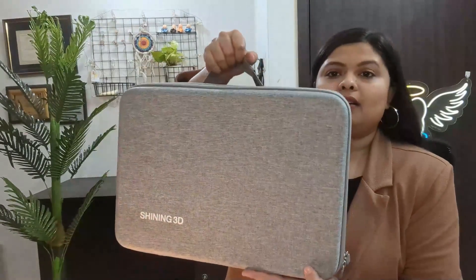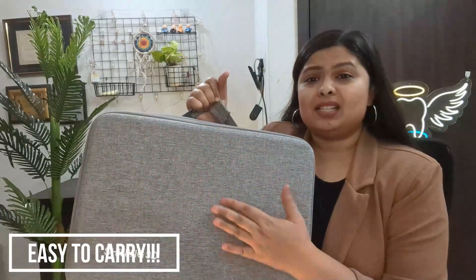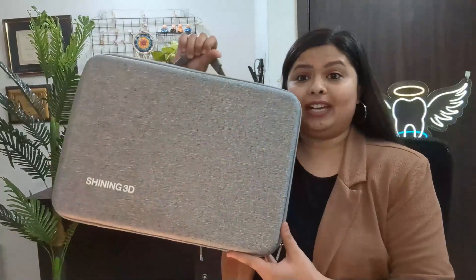This is the packaging — I really love it because it comes with a handle, so it is easy to carry and very sturdy. If I want to carry it for consultations or to another clinic, I can carry it freely. Now we are going to open the box and see what all is inside.